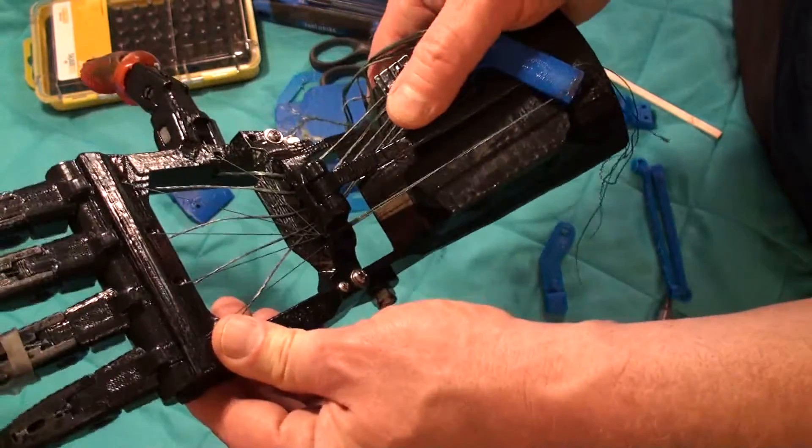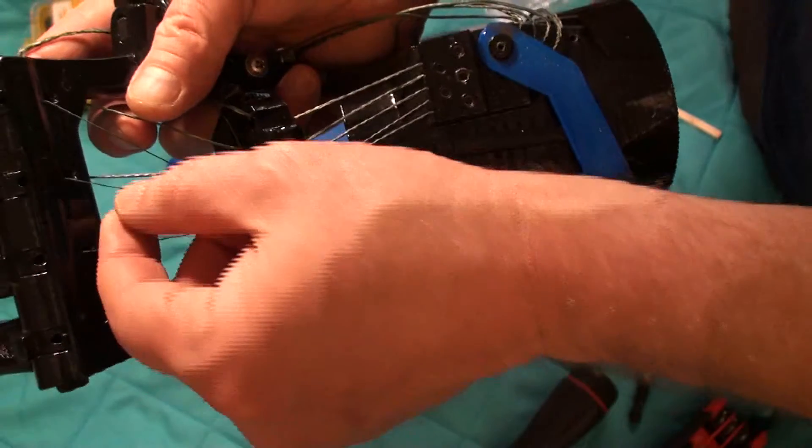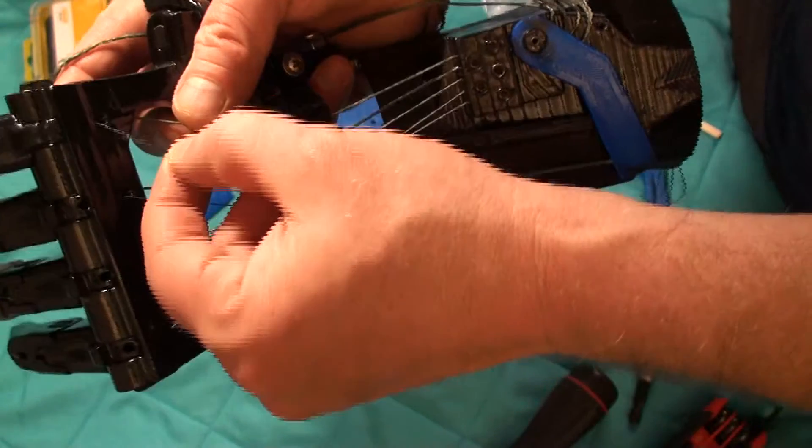Let's follow the extensors now. The extensors here are these thin cables — they're much thinner. Like I said, the flexors are 250 pound line, and this is 80 pound Dyneema — it's a braided fishing line.